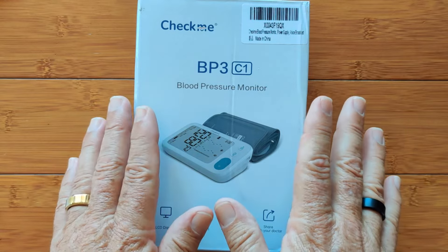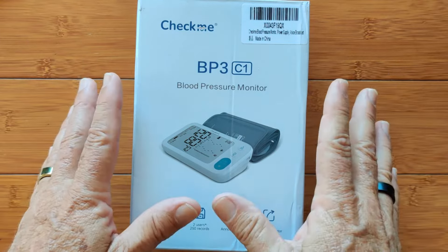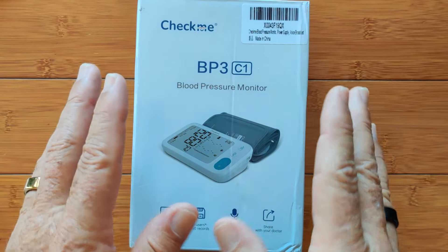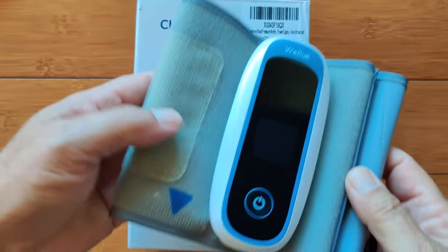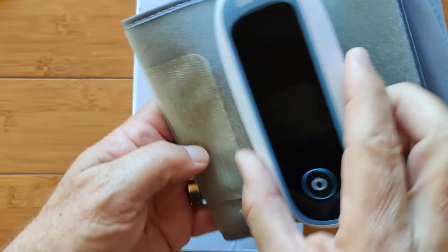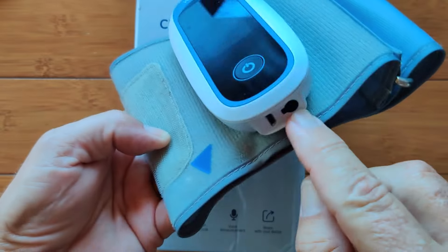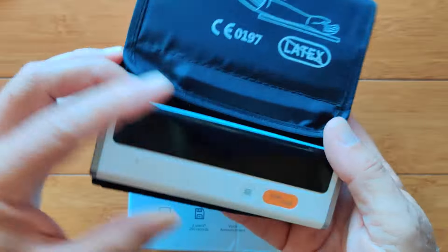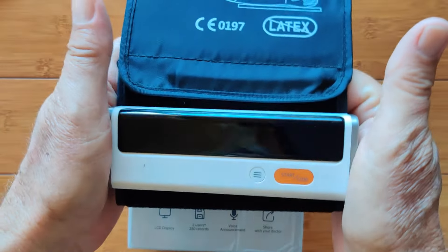Blood pressure is one of the most important readings you can have, and one of the weakest links in smartwatches. A lot of them are starting to leave it out because they know the accuracy isn't there. But cuff-based devices are accurate. We've already reviewed some that are really good — some that do blood pressure plus blood oxygen, and another that does blood pressure with EKG plates.